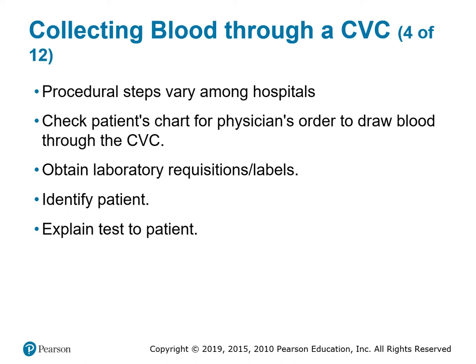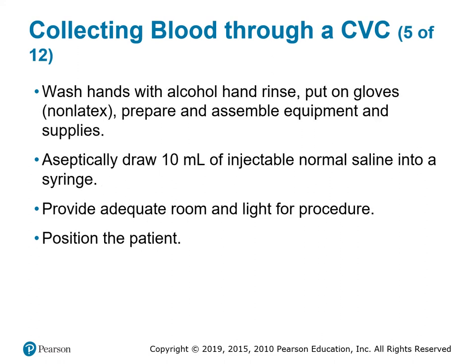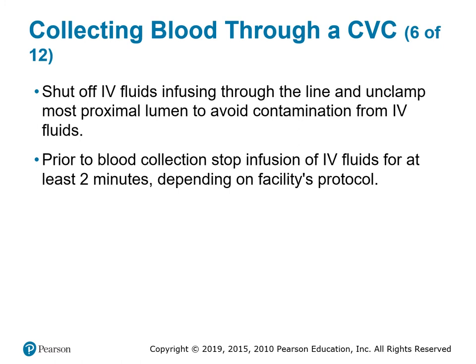All right. Check the patient's chart for a physician's order to draw blood through the CVC, obtain the laboratory requisition or labels, identify the patient, explain the test to the patient. Wash hands with alcohol hand rinse, put on non-latex gloves, prepare and assemble equipment and supplies, aseptically draw 10 milliliters of injectable normal saline into the syringe, provide adequate room and light for the procedure, position the patient, shut off IV fluids infusing through the line, and unclamp the most proximal lumen to avoid contamination from IV fluids. Prior to blood collection, stop infusion of IV fluids for at least 2 minutes, depending on facility's protocol.